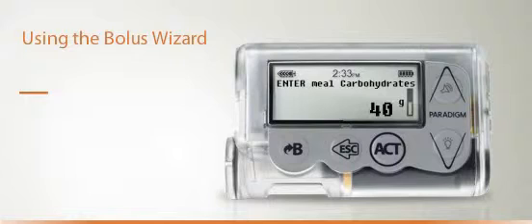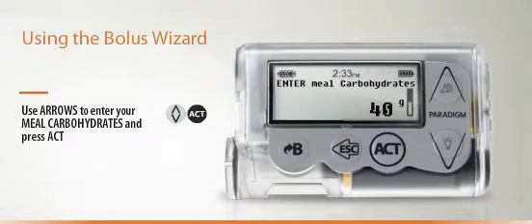The Bolus Wizard will now ask you for your food estimate in carbohydrate grams or exchanges. Enter this using the up and down arrows, then press Act.